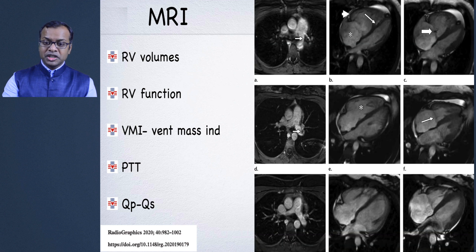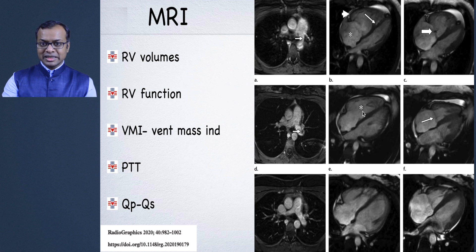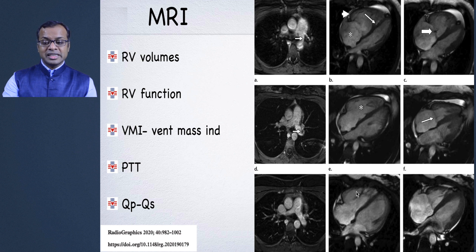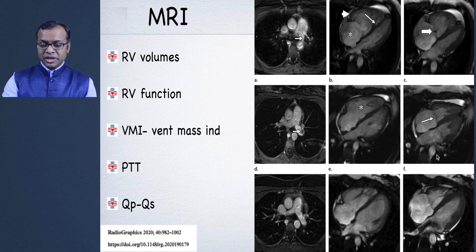In one patient presenting with acute pulmonary embolism, MRI showed a dilated right ventricle, straightened interventricular septum, and tricuspid regurgitation. On follow-up, the RV was still slightly dilated but improving, and later the pulmonary embolism resolved with RV size returning to normal and tricuspid regurgitation resolving. MRI is great for serial follow-up with no radiation exposure.